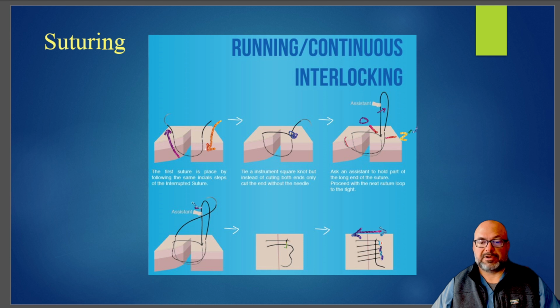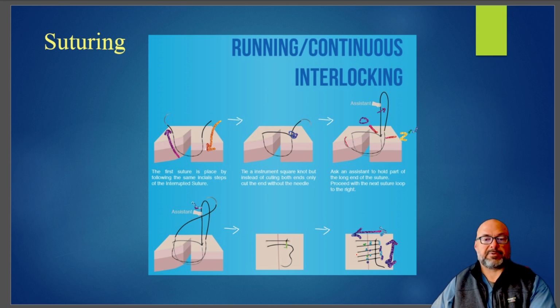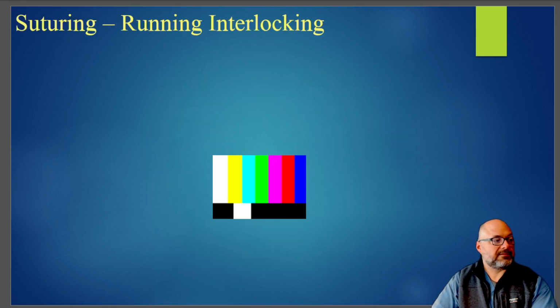so that you're getting compression not only side to side, so perpendicular to the axis of the incision, but this is also creating tension and pressure longitudinal to the incision, so that if you've got areas in between the suture that could be bleeding, as for example the hysterotomy at the time of C-section, this is going to be putting pressure on those spots. So let's take a look at that.